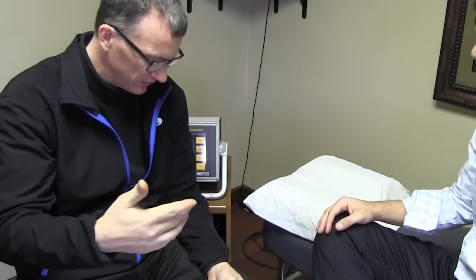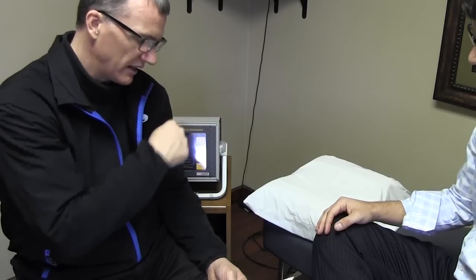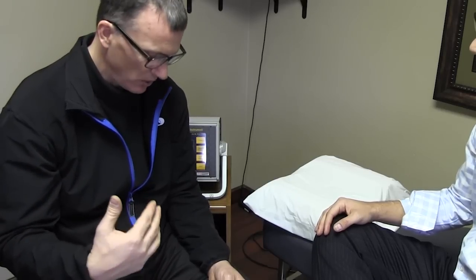We asked you all these questions if you have any kind of familial history of cardiovascular disease and so forth. These were the questions that we had to enter into your data file on this test. Your systolic blood pressure was 121 and your diastolic was 67. So you're 121 over 67. Your mean arterial blood pressure was 90. Pulse pressure was 54, and you were at 63 beats per minute. All right. Now the large artery elasticity index was 19.4, and the small artery C2 number was 10.2.